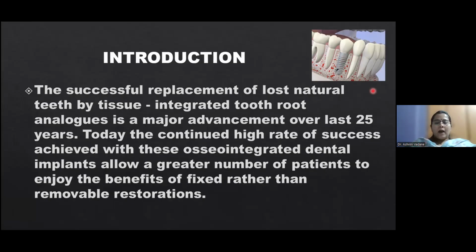Today, the continued high rate of success achieved with these osseointegrated dental implants allows a greater number of patients to enjoy the benefits of a fixed rather than a removable restoration. This is a good advancement in dentistry over the last 25 years, dental implants.